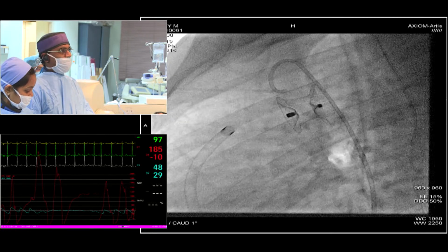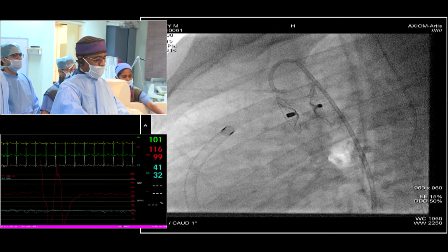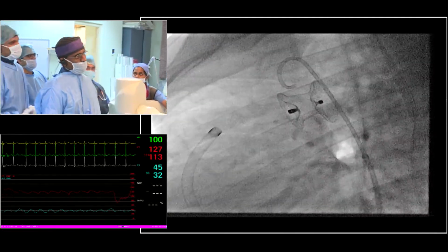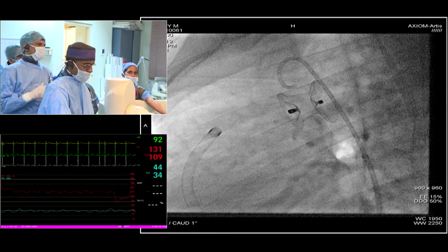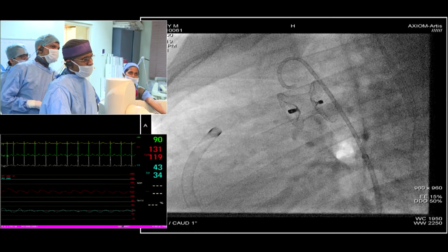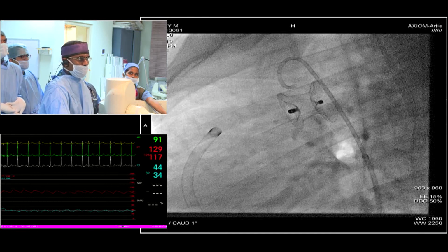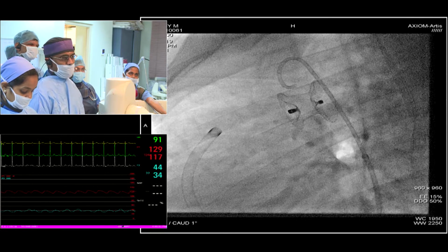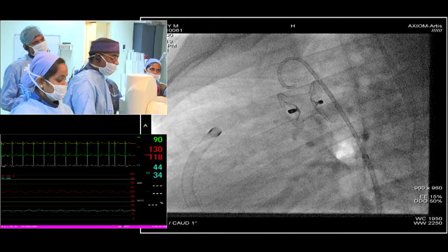Oh no, I was taking a repeat aortogram just to see whether the residual flows have completely gone off, and second thing is whether the device is very, very secure or not. PA angiogram, the pulmonary arteries were massively dilated, and I think there is no concern about any of the branch PAs being compromised. But if you want, I can do a PA angiogram also. No, I misunderstood you. I thought you were doing a PA angiogram. You've already done an aortogram. Residual flow is minimal, no consequence. And even if it is there, you're not going to do anything about it.